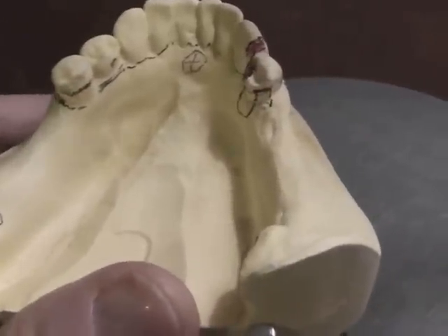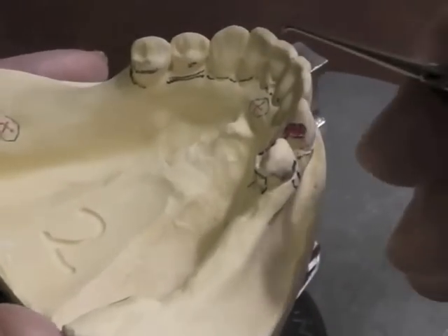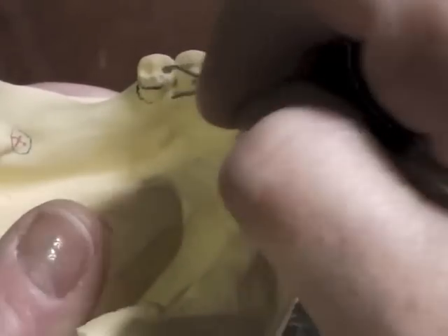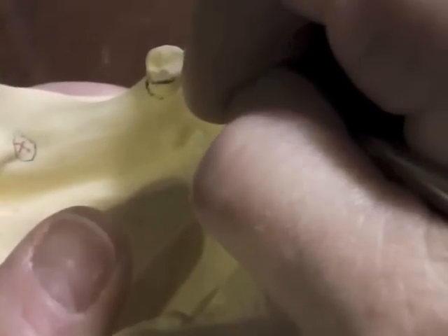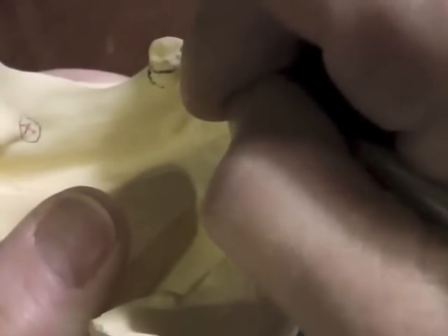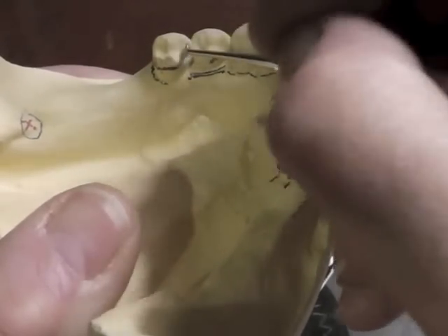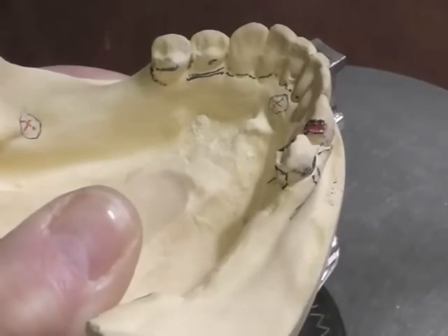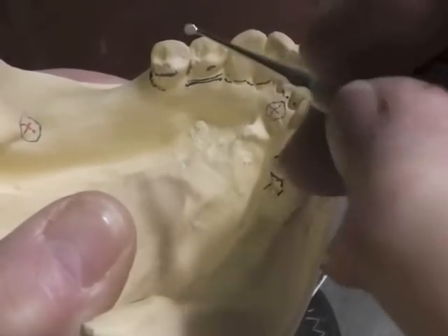We'll go to the other side. Again, we had enough room for the eye bar on both sides, and that's our clasp of choice. I'm going to prepare my rest seat for the eye bar — for the RPI system — removing about a millimeter to a millimeter and a half at my marginal ridge, and then preparing a positive seat into the mesial fossa of my premolar. I want to have a positive seat so my rest is not able to fall off.